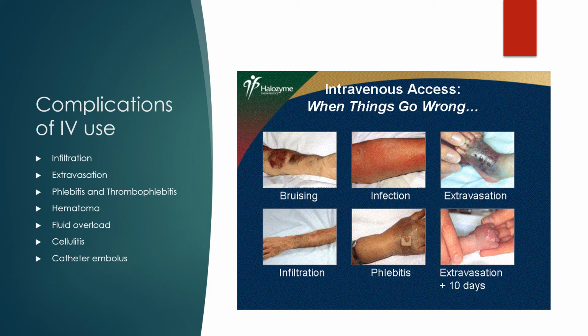Phlebitis, to prevent phlebitis or thrombophlebitis, the big thing is we have to change that IV site. The recommendation again is to change that IV site every 72 to 96 hours. Check your facility. If your patient arrives with the IV, you should change the IV within a 24-hour period of time of arrival. We do this because we can't verify the sterility of this placement.